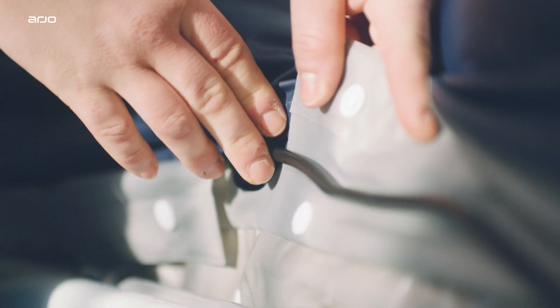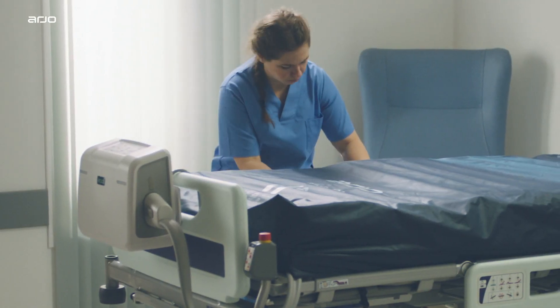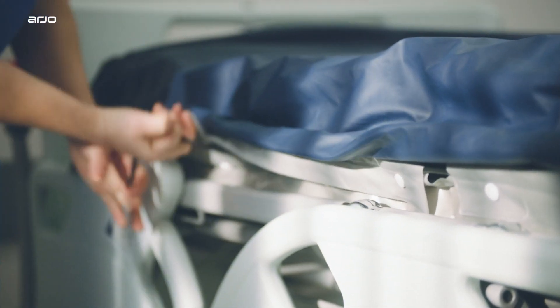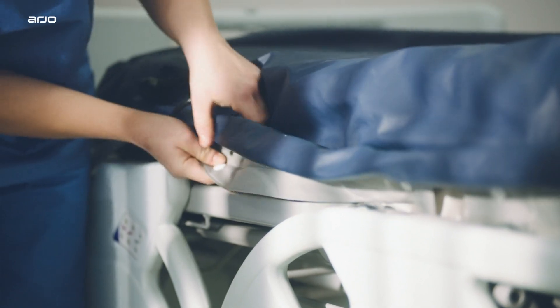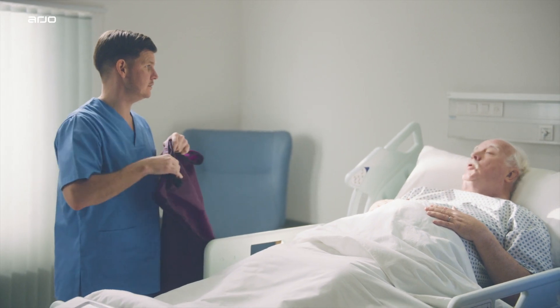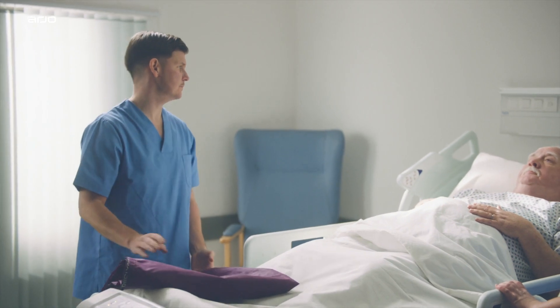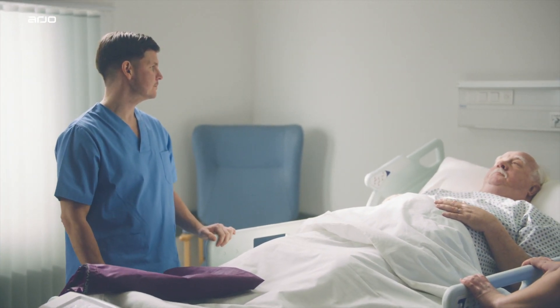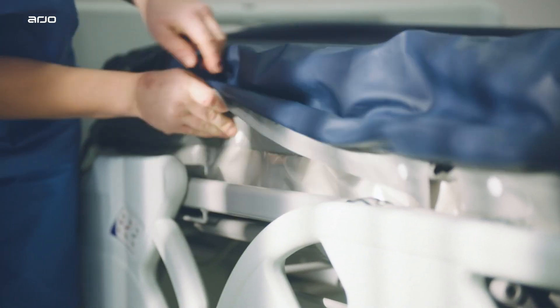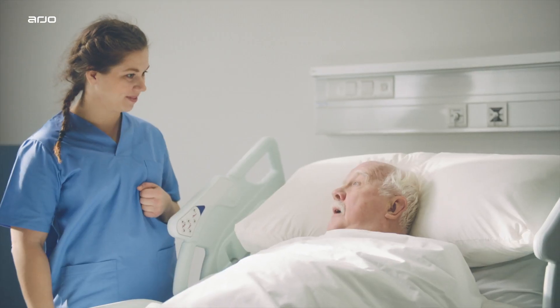Cable management. To prevent a trip hazard, the mains power cable should be put through the cable management flap located on the left-hand side of the mattress base cover. This design reduces the risks associated with trailing cables for patients and caregivers, whilst helping to maintain access for patient handling and repositioning equipment and nursing procedures. It is also possible for the cable to be brought out halfway within the flap, supporting flexibility for mains power access.